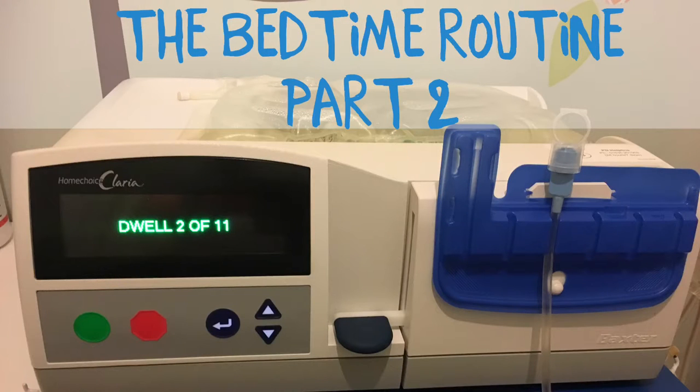What follows is part two of Ethan's bedtime routine: the setup of the dialysis equipment. This setup differs from country to country; this particular routine is taken from Great Ormond Street and the manufacturer's Baxter.